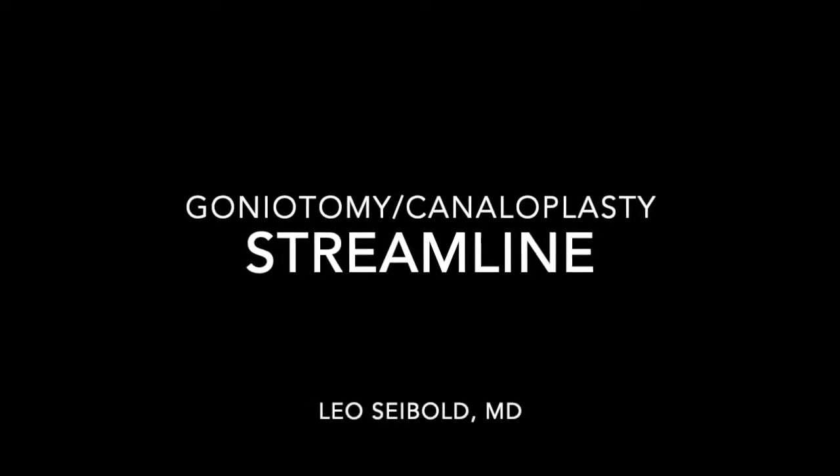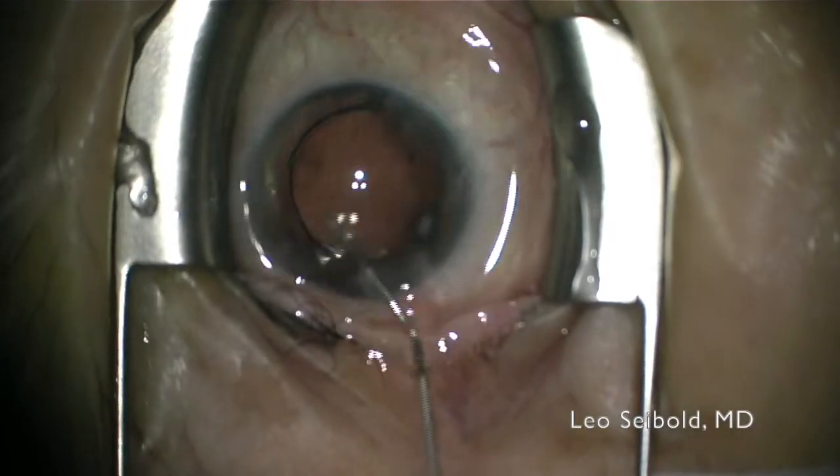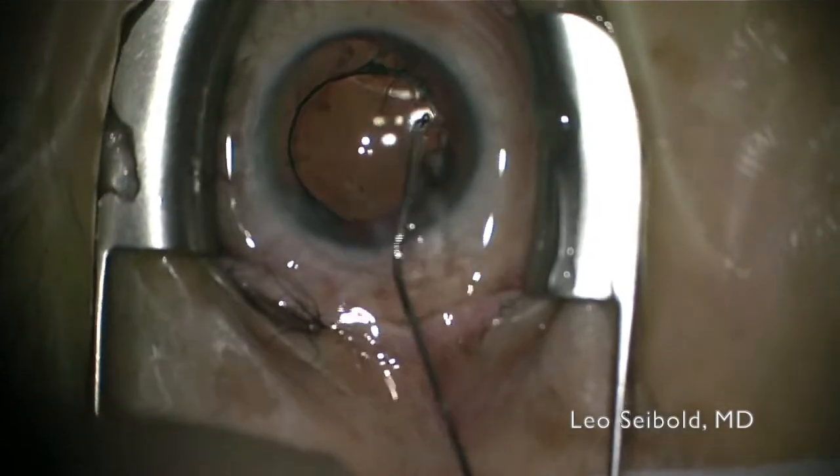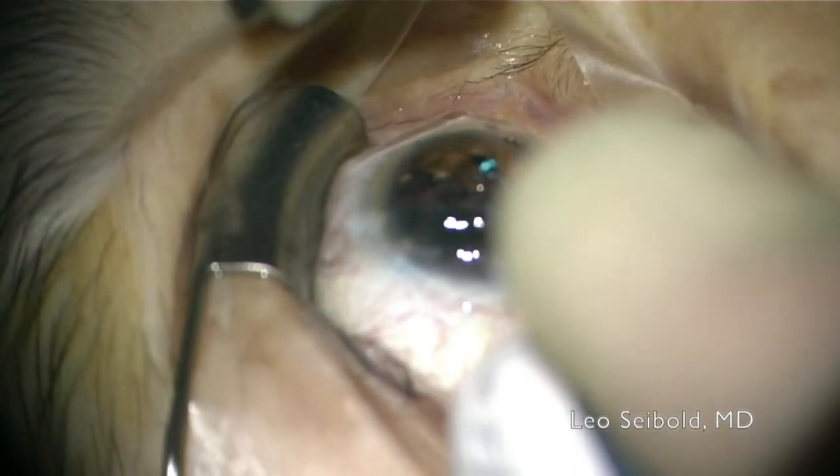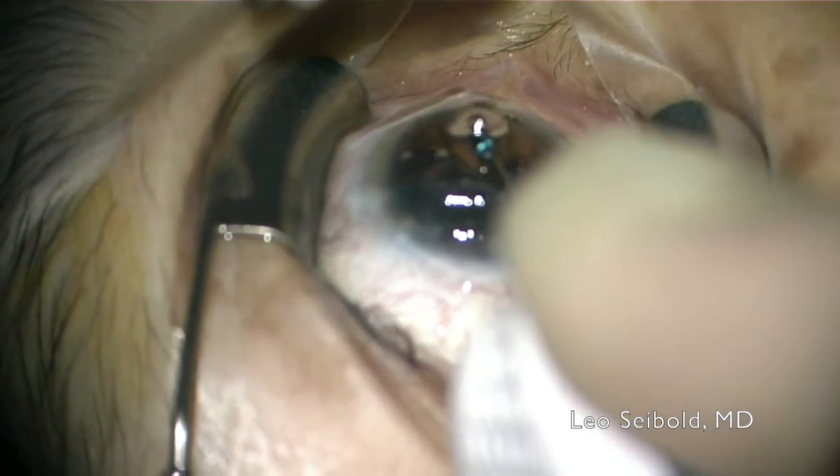Hi, this is Leo Seibold from the University of Colorado. I'm going to be showing a couple of cases of the new Streamline surgical system from New World Medical. What's nice about the Streamline system is the design really helps you to optimize the surgeon's experience and the control that you get when performing goniotomy and canaloplasty.